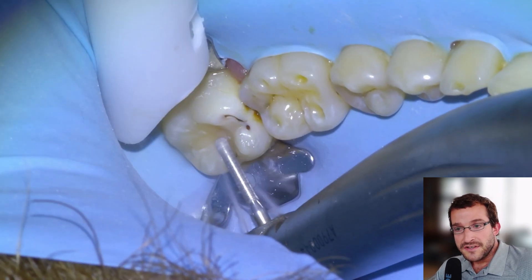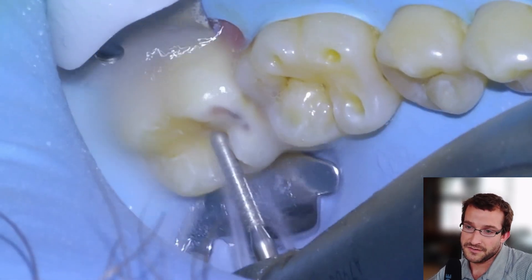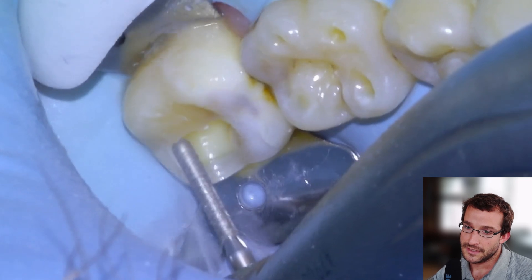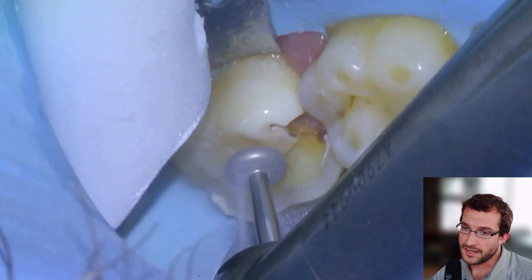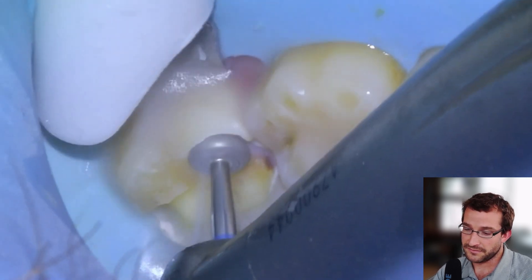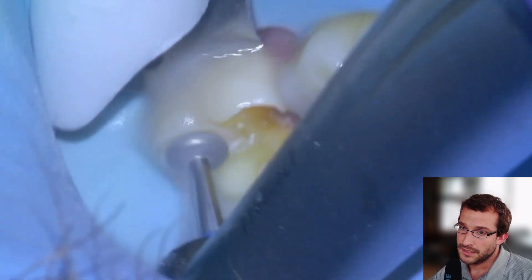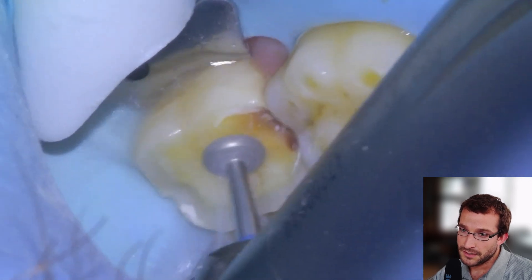We'll get started with the case here — 3-7, big cavity on the mesial, you can see there. Froze with Articaine 1-in-200, long buccal and a nerve block. We're just going to take a millimeter and a half off the occlusal surface with a KS1 from the lingual side, and then a large wheel from the buccal side. Trying to do a little bit of anatomical prep here, then we can get a little bit closer to the pulp chamber, which makes instrumentation a little bit easier.